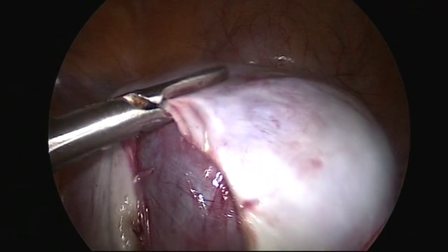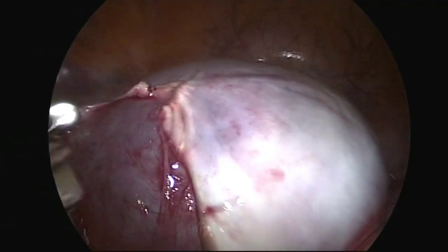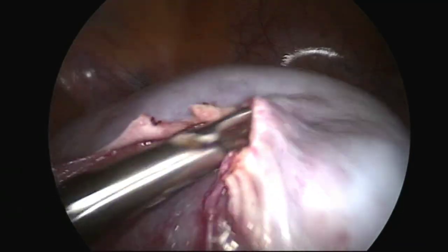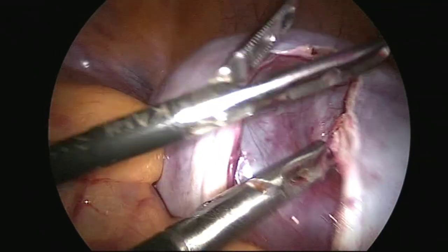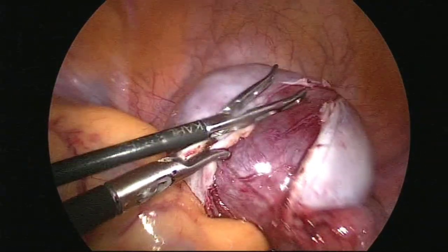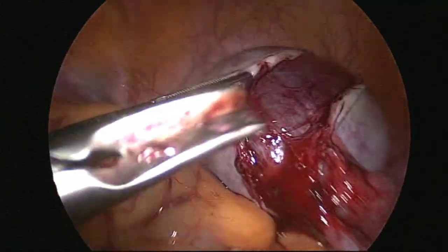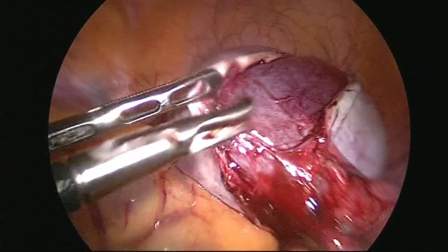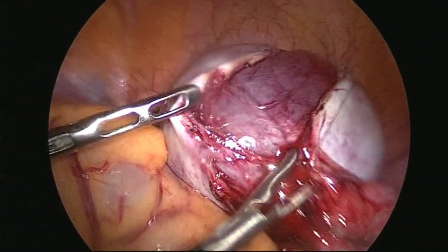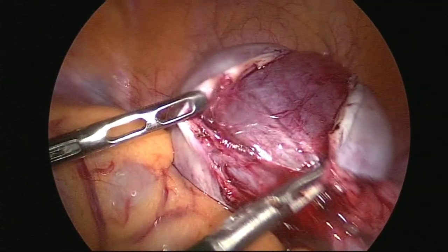When I am cutting, at the same time I am lifting my instruments so that energy cannot spread to the ovarian cyst. And if I touch my bipolar to the ovarian cyst, then there is possibility of rupture of the cyst, which I don't want. Now more than 50% of the job is done. Now I just have to separate a few fibers. Little bleeding, control, just one or two bursts are there.